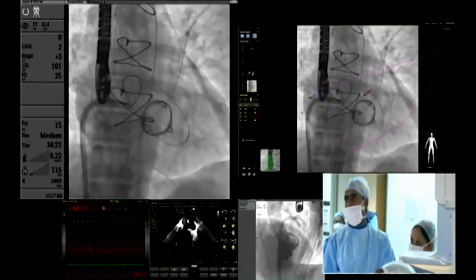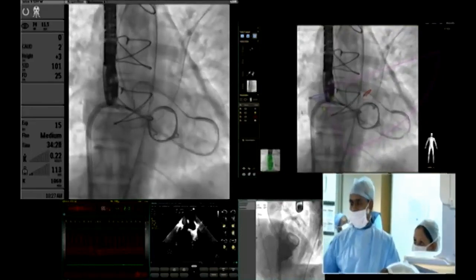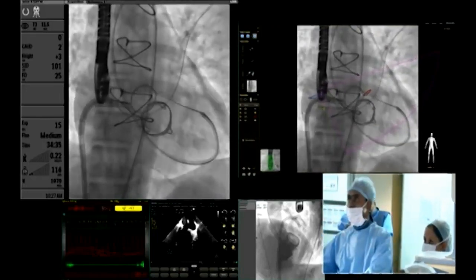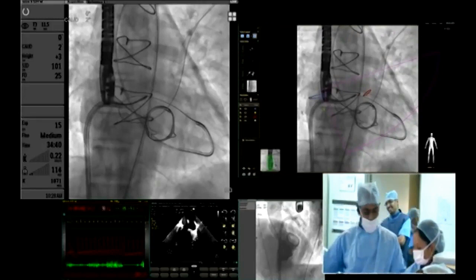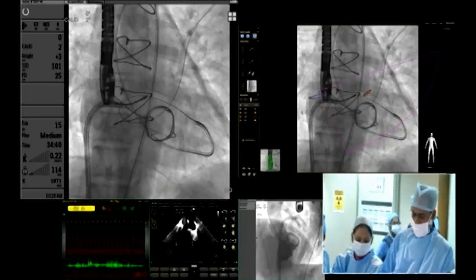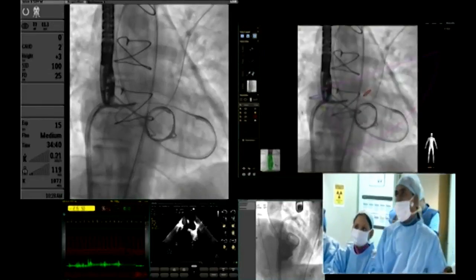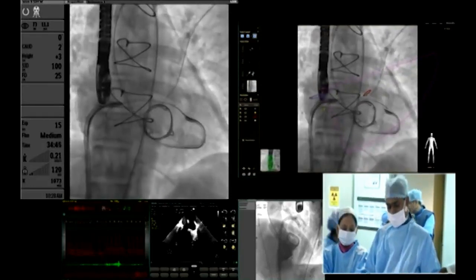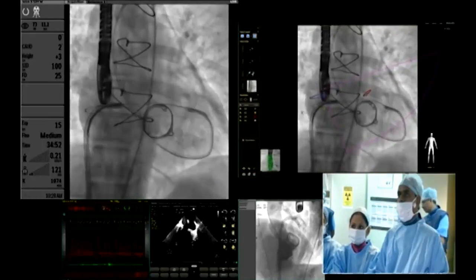A new sheath again might not kink — just because it kinked once does not mean the next one will also kink. That is another option. So most people, once you talk about periprosthetic leak, the steps told are relatively straightforward: cross with the wire, take a sheath, and deliver it. Here you see the nuances — everything is there in front of you in two dimensions, but the third dimension is telling you that you are out of plane and advancement of the gear over a wire may not be all that easy.